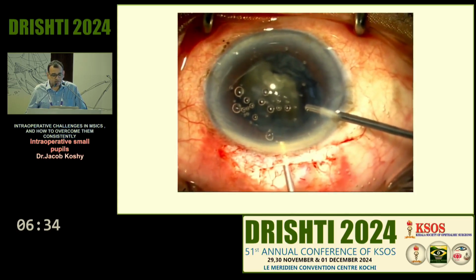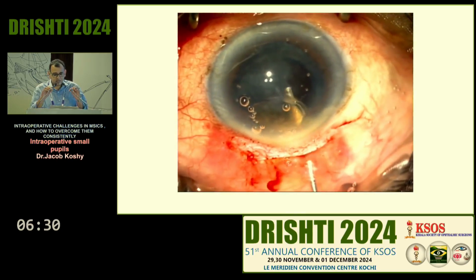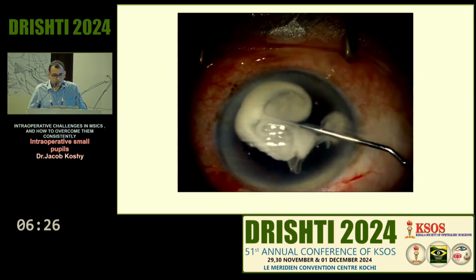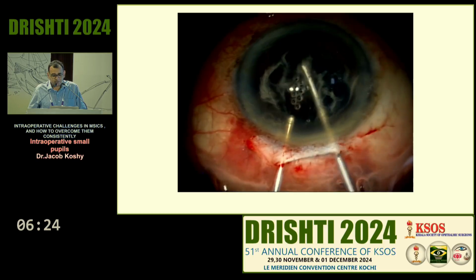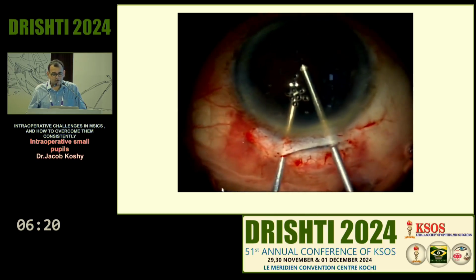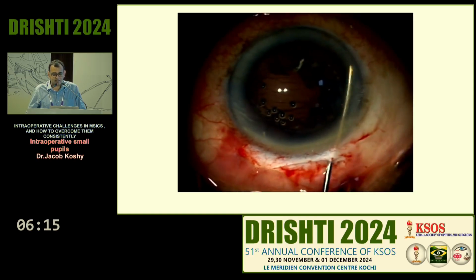Good anterior vitrectomy is mandatory in these cases, and fortunately the vitreous was a little gel, and I did a little bit of vitrectomy, cleared it up and could get it out. Triamcinolone is a must to make sure you're cleaning up adequately. For all the VR surgeons here, things may be very easy, but for us anterior segment surgeons, sometimes it's not.